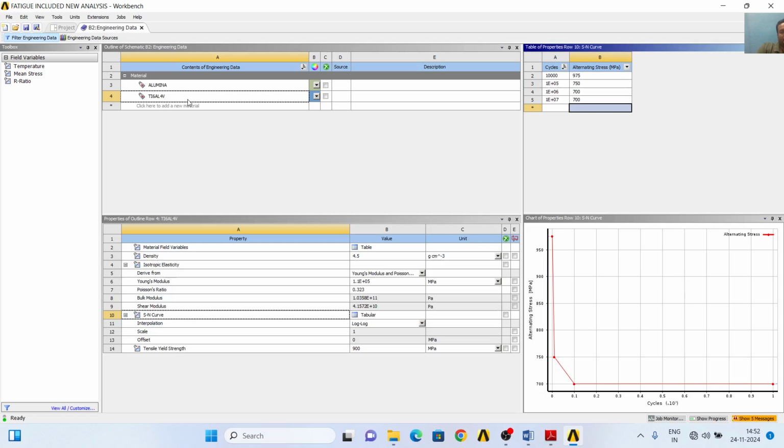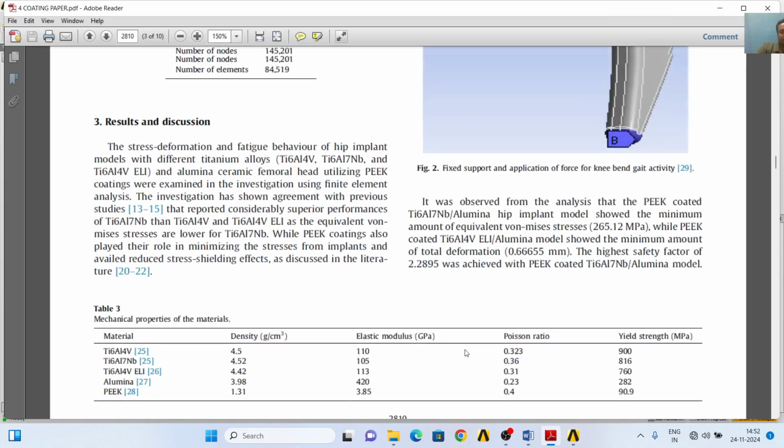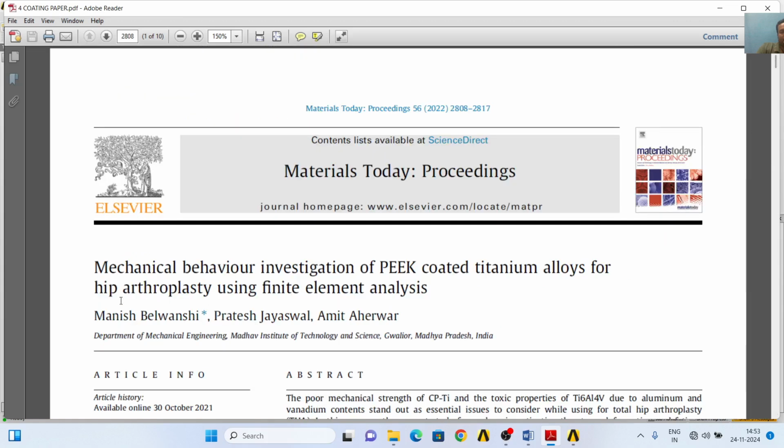You can also add some other mechanical properties of other materials as well, such as here I have added the properties of titanium 6Al-7Nb, titanium 6Al-4V ELI, alumina and PEEK. There are other properties as well. You can refer to my paper, namely Mechanical behavior investigation of PEEK coated titanium alloys for hip arthroplasty using finite element analysis.